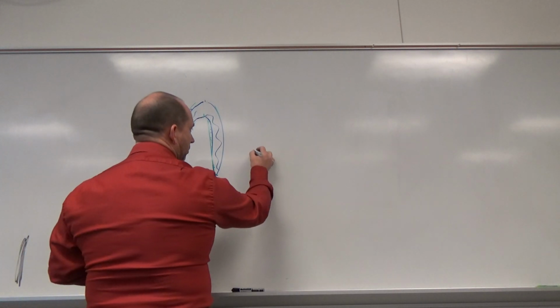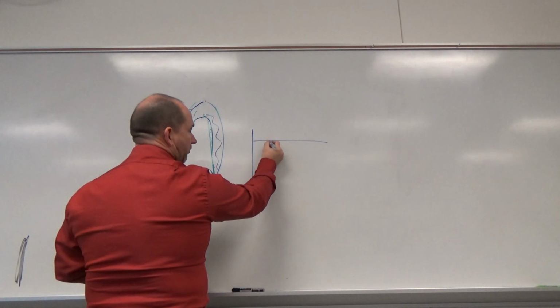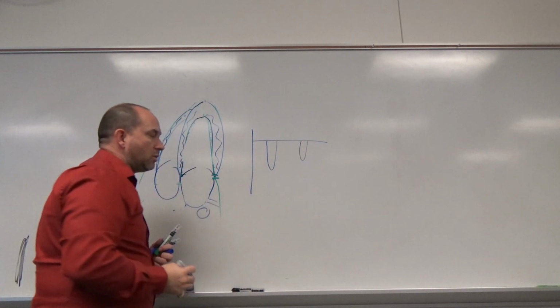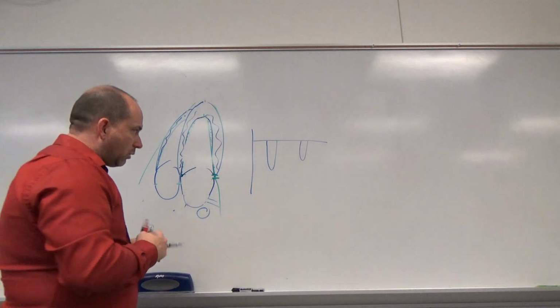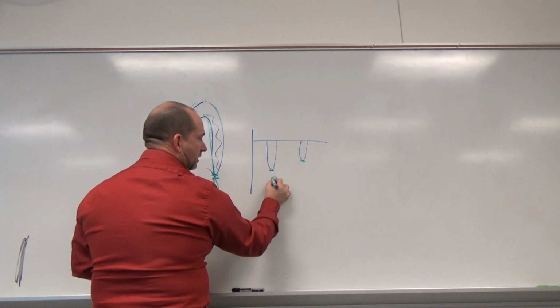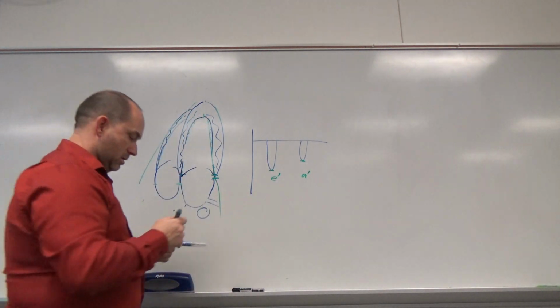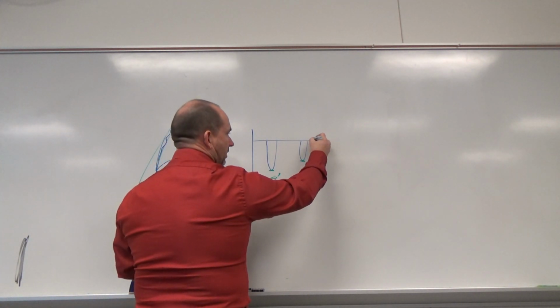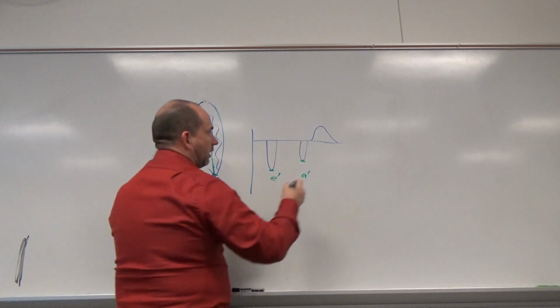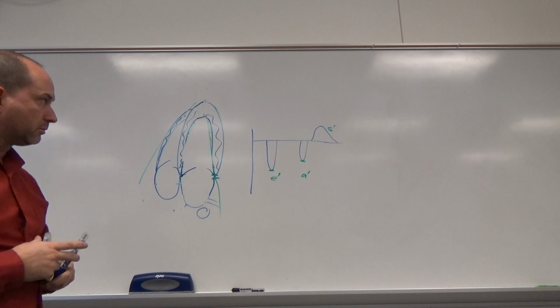So in this, we're going to bring our baseline near the top. And we're going to look for very low velocities. So we're going to actually have a very intense signal. And it's going to be the E wave and the A wave. We are going to measure these. So this is all diastole. So this is called E prime. So it's usually a small e or lowercase. And A prime. If we're to complete this, there's actually after that, there's actually a systolic wave beyond that. So this would actually be S prime, small s prime, on the tissue Doppler.